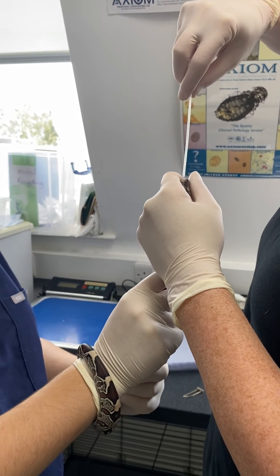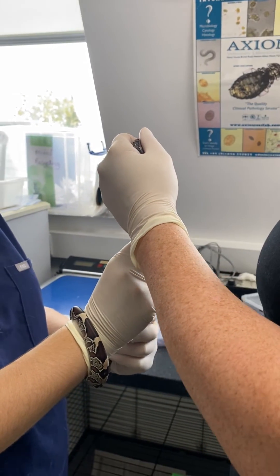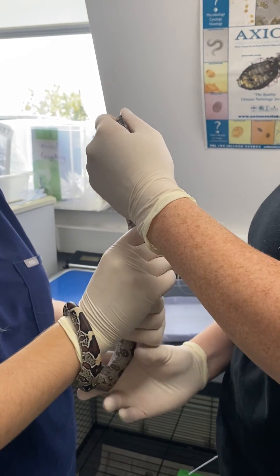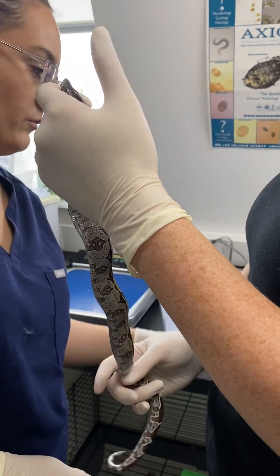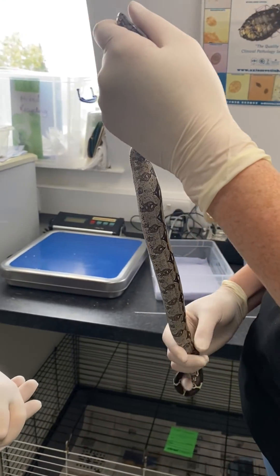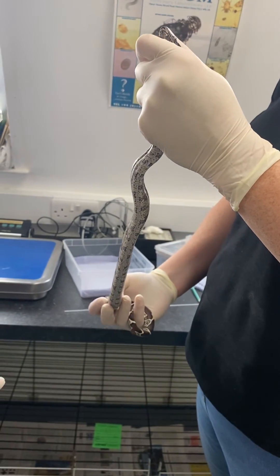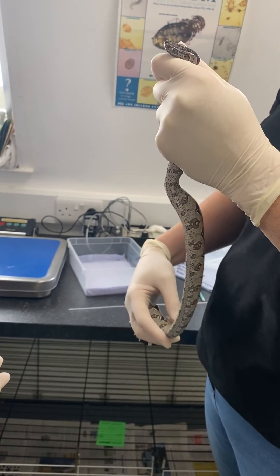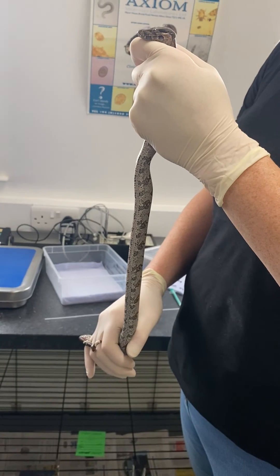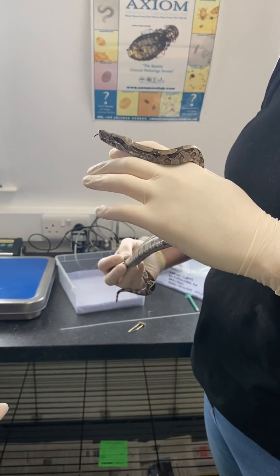We're holding that snake vertically, making sure all of that material has gone where we want it to go — beautiful — and it's not going to regurgitate. You can syringe in between 15 and 30 ml per kilo. Obviously regurgitation is at a higher risk when you're giving larger volumes, but for medications given this way it's only a very small amount, so that's not going to be a problem at all.